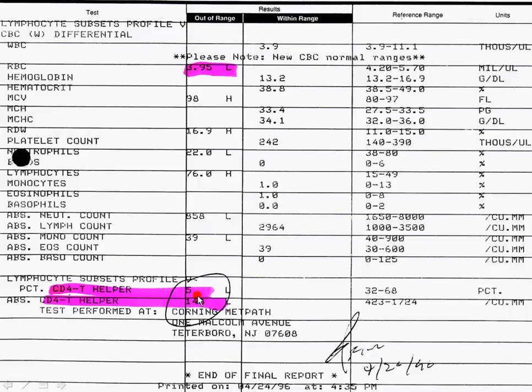So when we're looking at this, we want to look at the number. The L in this box indicates that it's out of range and on the low end of normal. If the results were within range, they would be in this box.